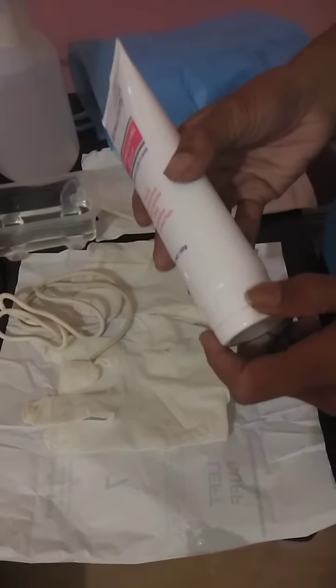Squeeze the lubricant gel on the open sterile catheter package. Be careful not to touch the package. Depending on your agency policy, you now apply either a pair of sterile gloves, or a sterile glove on your dominant hand and a clean glove on your non-dominant hand.